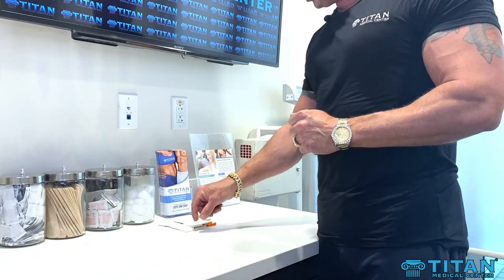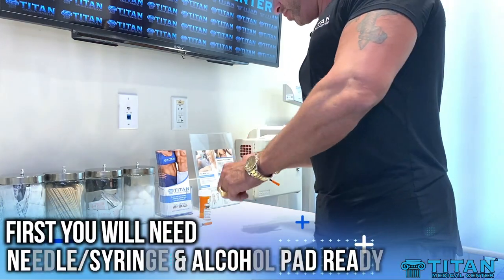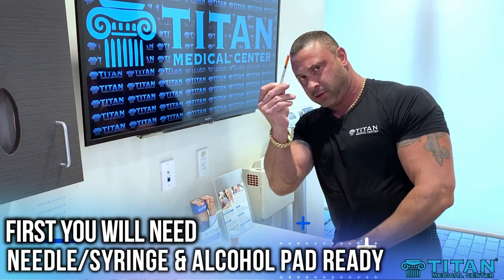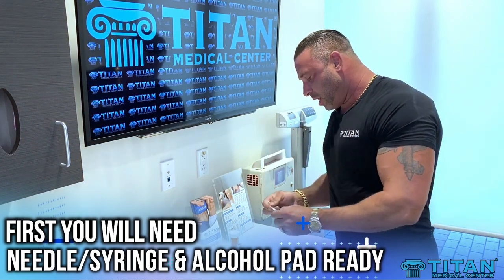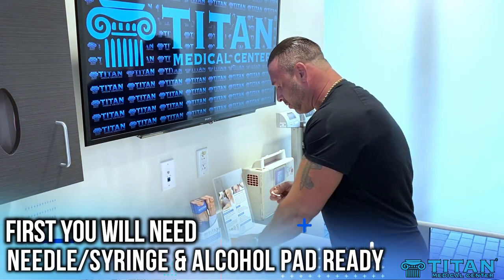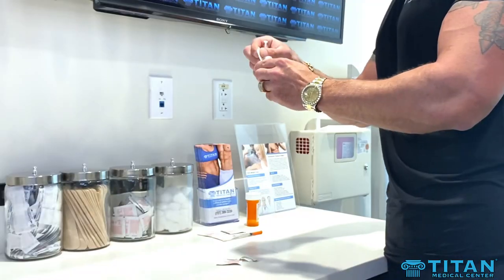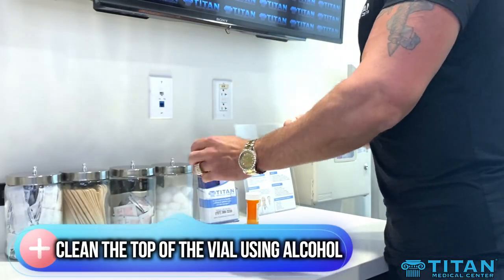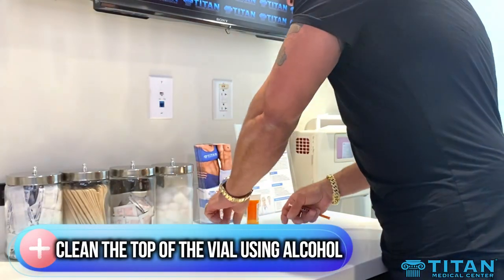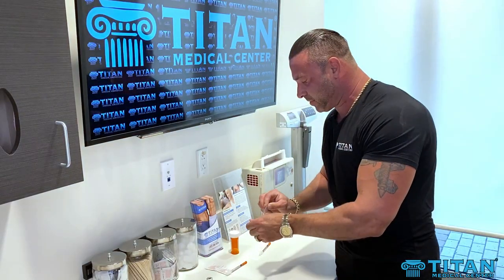So for a subcutaneous injection, the first thing we're going to get is our needle and our alcohol pad. We're going to make sure the first thing we do before the subcutaneous injection is make sure the site is cleansed and the bottle is cleansed. So we cleanse the bottle and we're going to let that dry here for a second.